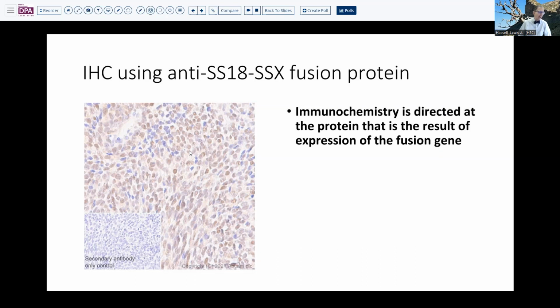Now, most commonly, they're biphasic tumors, which have an epithelial component. And that's very helpful in the differential considerations, because if you can identify a cytokeratin-positive area or an EMA-positive area and a characteristic glandular or pseudoglandular formation, that is virtually diagnostic. There's hardly any other tumor that will give you that appearance. But in our particular case, we did not have that. And so the identification of the fusion gene proteins and so forth was very helpful in arriving at the diagnosis of synovial sarcoma.